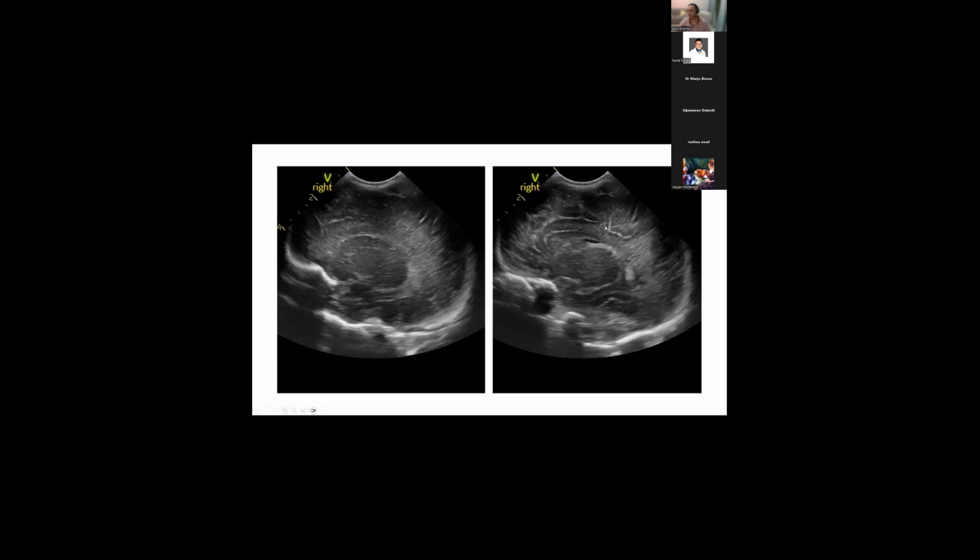Now, one comment, anybody, can you tell me what's going on with that image on the right? There is some flaring in the lateral ventricle. There is flare that's visible in this region. He's a preterm baby, but he's 34 weeks and there's no cysts. This is really just frontal blush. But I haven't opened up the C completely of the lateral ventricle on this right side.